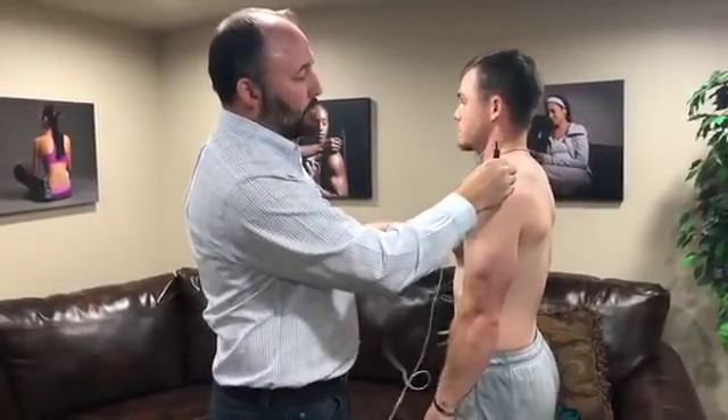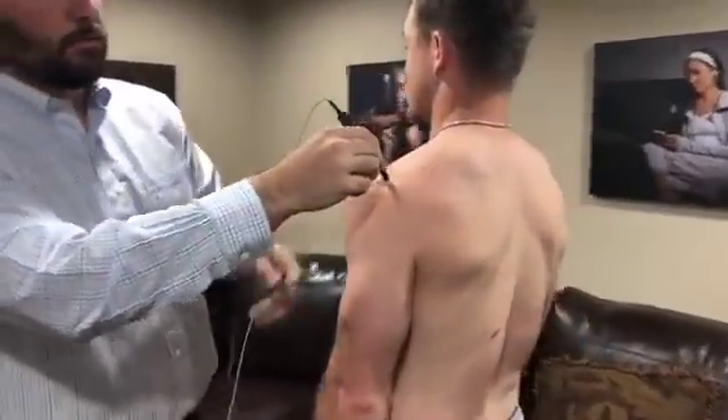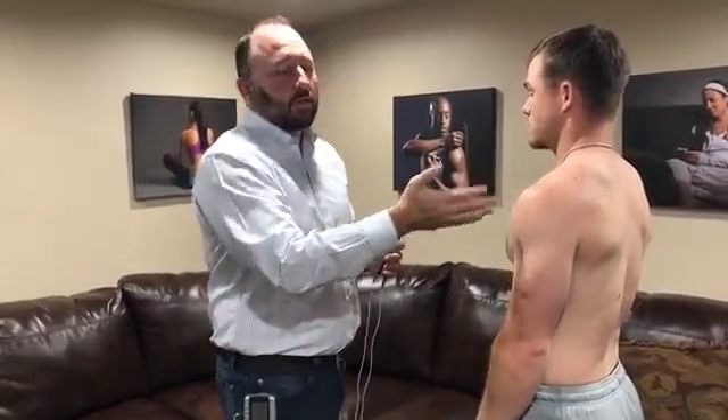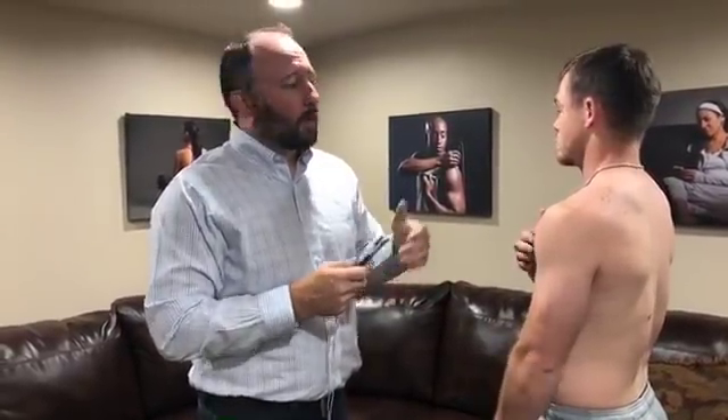That again is going to take about two minutes. If there's still elevated pain, find that one spot that's really bad, keep a probe right there, and move your other probe around 10 seconds at a time across the body as well. Then reevaluate — at that point, usually having good relief, you put the ear clips on for 20 minutes. You treat the peripheral area, the central by going across the spine, and the central by treating the brain with the ear clips. Steve has asked how long will relief continue after treatment. Our typical relief with the very first treatment — I'd expect anywhere from 12 to 48 hours. It's cumulative with continued use, so he'd get 24 or 36 hours next time and it would build from there. Adding the ear clips after your probe treatment increases that duration as well.